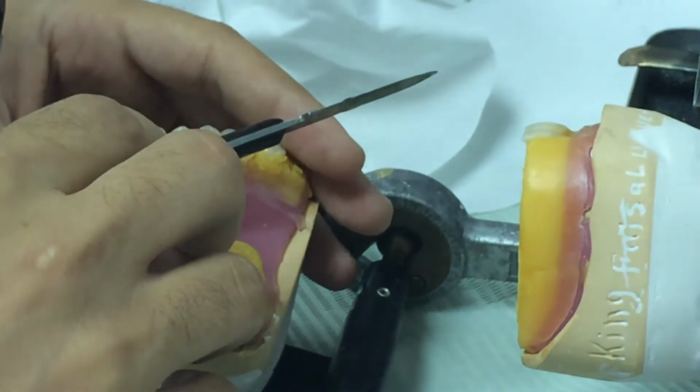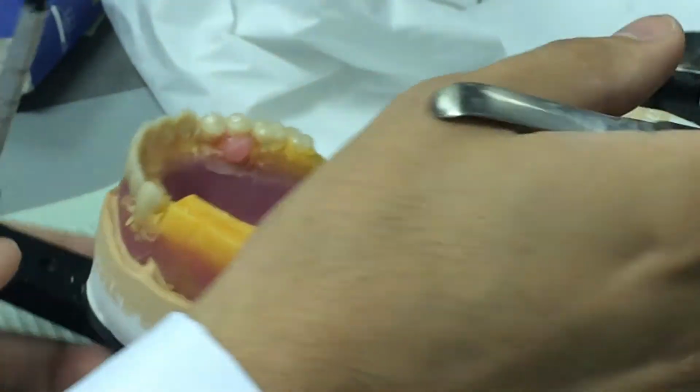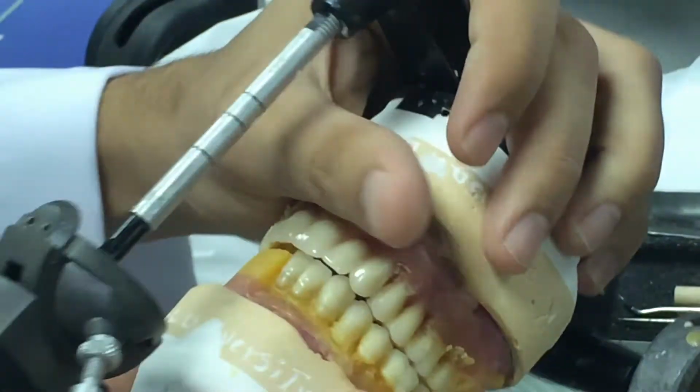So we have to do something we call trimming. So the trimming, how does it have to be?